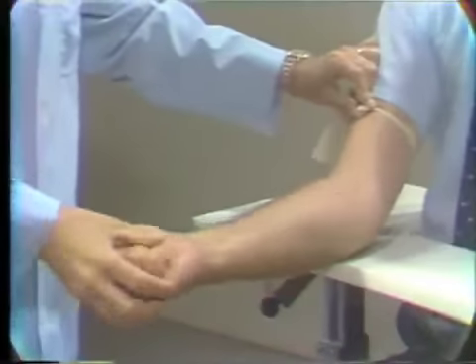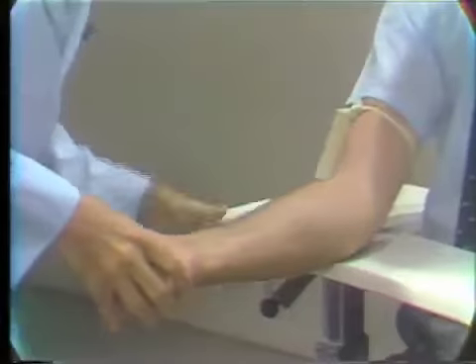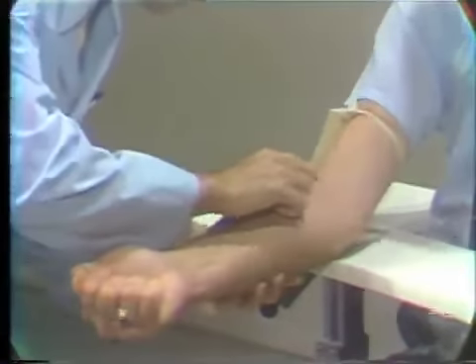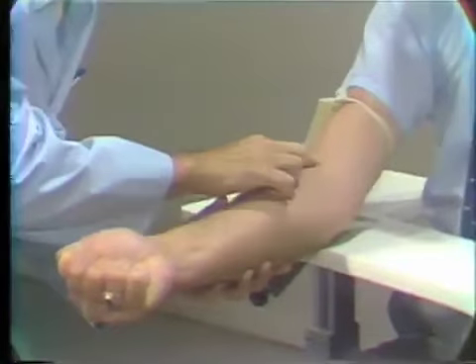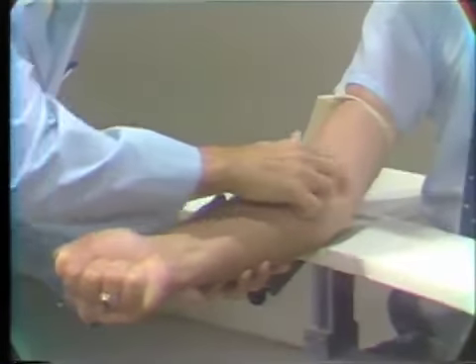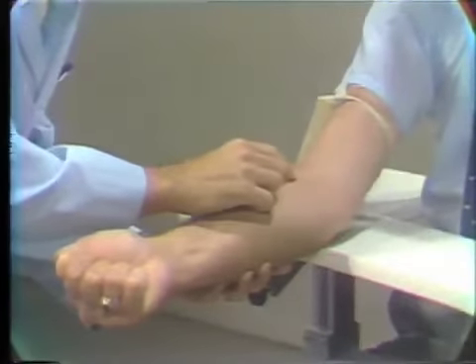Okay, have your patient make a couple tight fists. Then we will look for the best vessel. The antecubital fossa, the vessels I'm looking for are in this area. There are vessels off to the side. These are usually thin-walled vessels, and they tend to roll.